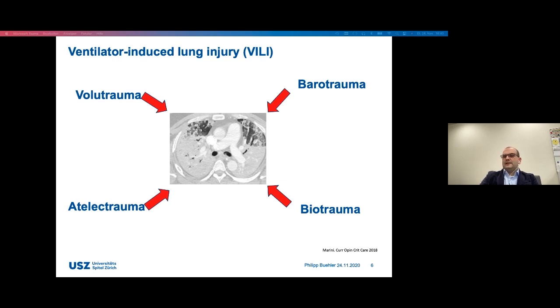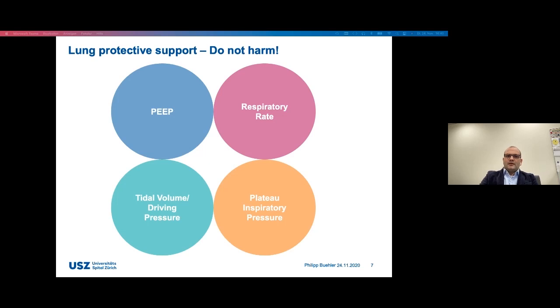The aim is to ventilate the lung as physiologically as possible and to prevent secondary damage to the lung by ventilation. Based on the ARDS literature, the currently valid standards of lung protective ventilation have been applied.